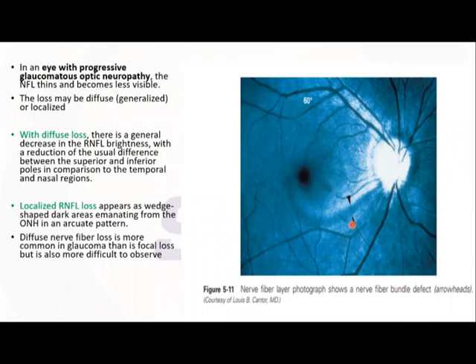So if there is an RNF defect, you can observe it like a defect in cellophane. With RNF, it's a glistening, tape-like appearance. It's just a practical tip, because many times the glaucoma specialist says it's an RNF defect, and we will not find it. The cellophane tape is like that, just a small practical tip.